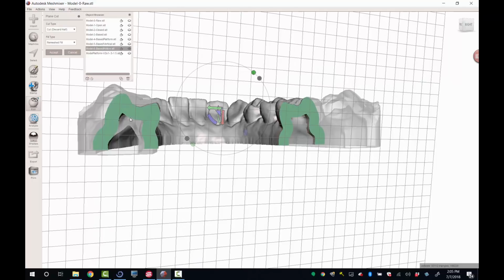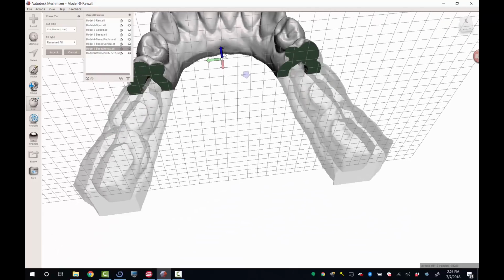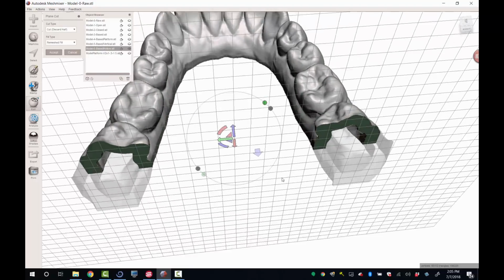If you had really steep central grooves, this area may actually dip down, and it means there's nothing supporting it, so that little area is going to fail to print. I don't think this premolar has too sharp of an occlusal groove, but let's see. Nah, it doesn't. Again, it's not a common problem, but it is something that always worries me.